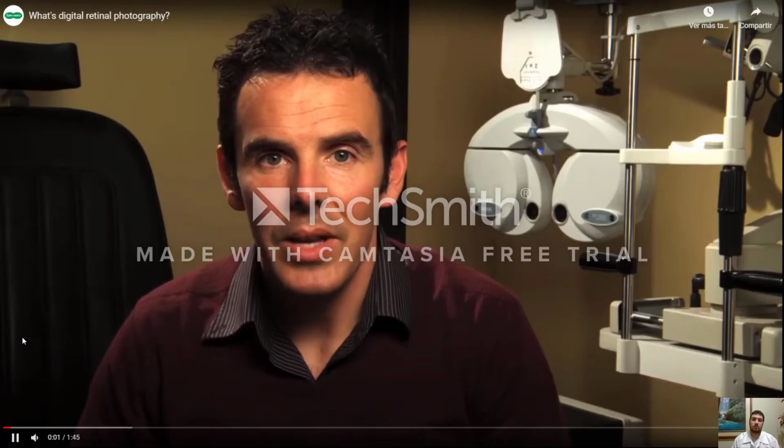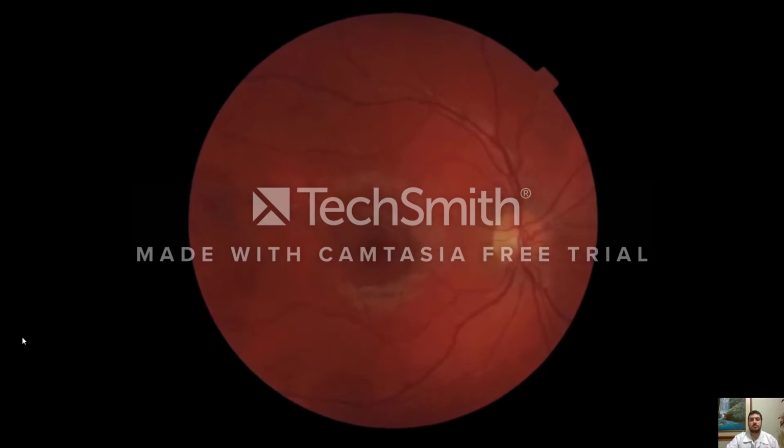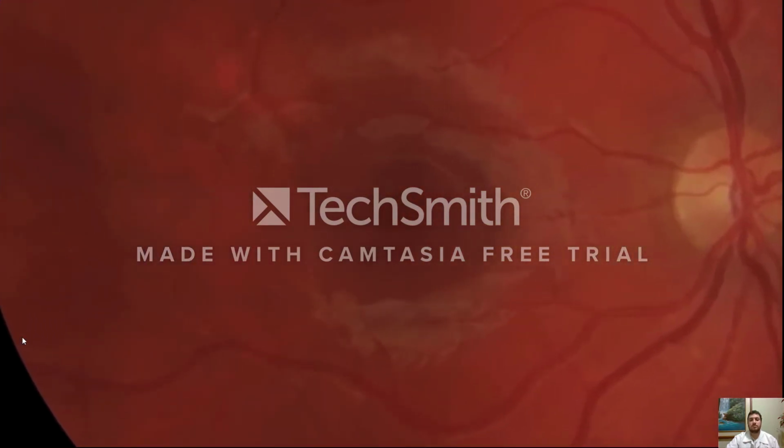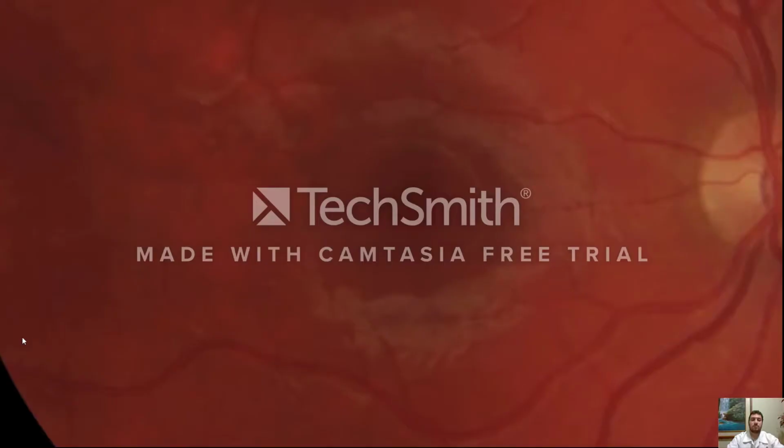You may have had a retinal photograph taken as part of your eye examination and wondered exactly what is my optometrist looking at. If you look at this photograph here, you can see this small dark area, which we call the macula. The macula is the most sensitive part of the eye, and in some patients as they get older they develop a condition called age-related macular degeneration, where they lose some of their central vision.